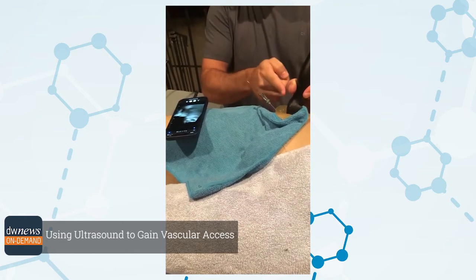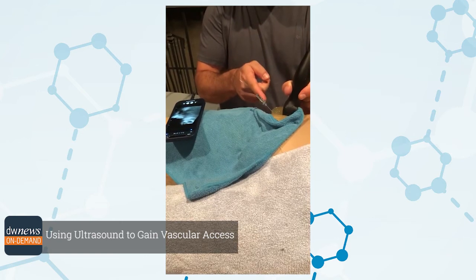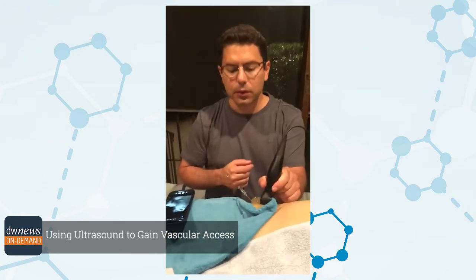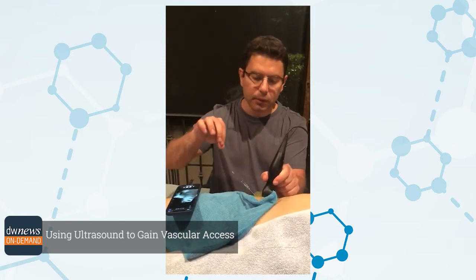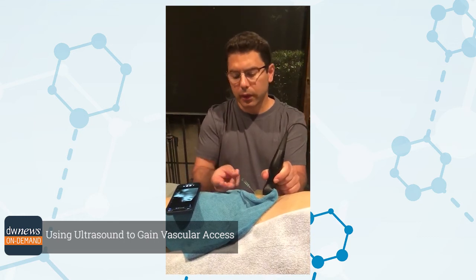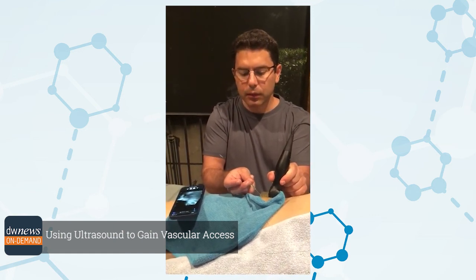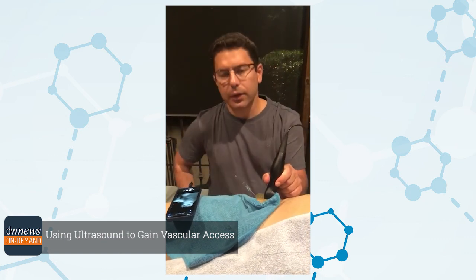Very important: do not take your hand off the artery once you have access, because by taking that off you may displace the needle — it can either go too deep or get out of the artery. Make sure you keep your ultrasound on the patient right before you thread the wire. And obviously if the wire doesn't thread, your assistant can hold the needle at that site, bring it down, or readjust the angle depending on how you access the artery.